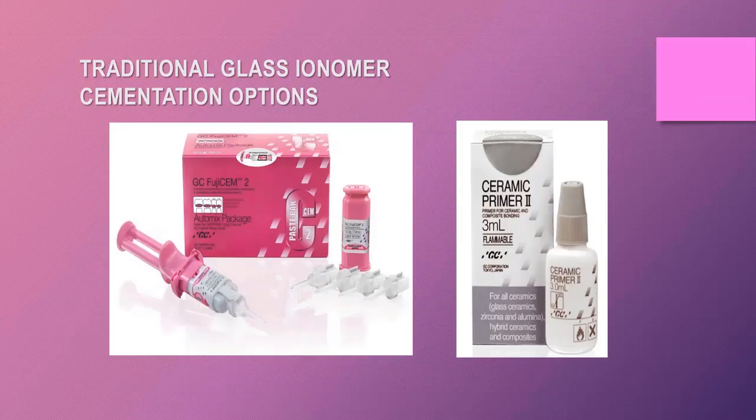Now, I mentioned ceramic primers there at the bottom because you can take a resin product and add in a ceramic primer, and a resin adheres to the ceramic primer, which allows it to adhere to a ceramic. And so we typically think of these with our resin adhesive restorations. But this will also work for your resin modified glass ionomers. Because there's resin present, you can use a ceramic primer.